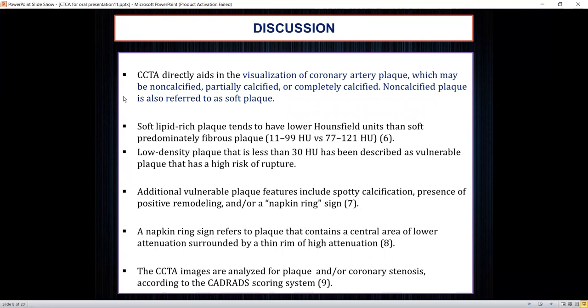CT coronary angiography aids in direct visualization of coronary artery anatomy and plaques, which are classified as non-calcified (soft) plaques, partially calcified plaques, and completely calcified plaques. Soft lipid-rich plaques tend to have lower attenuation than soft fibrous plaques. Lower density plaques with attenuation less than 30 HU are described as vulnerable plaques with a higher risk of rupture. Other features of high-risk plaques include spotty calcification and the presence of positive remodeling.